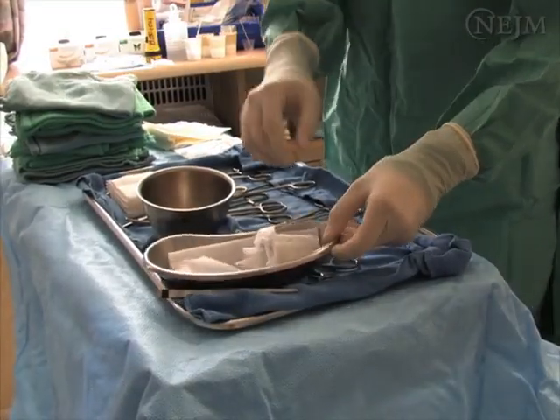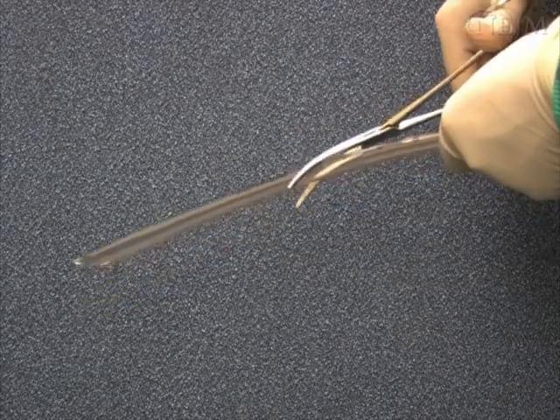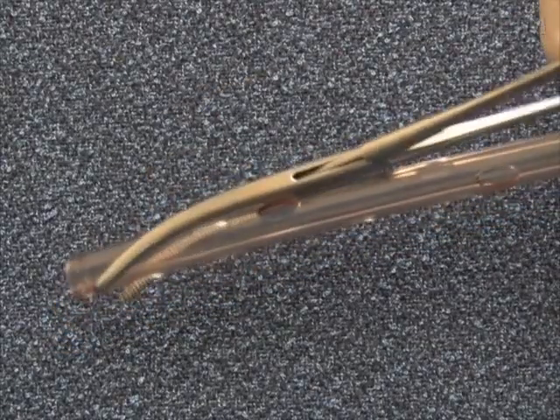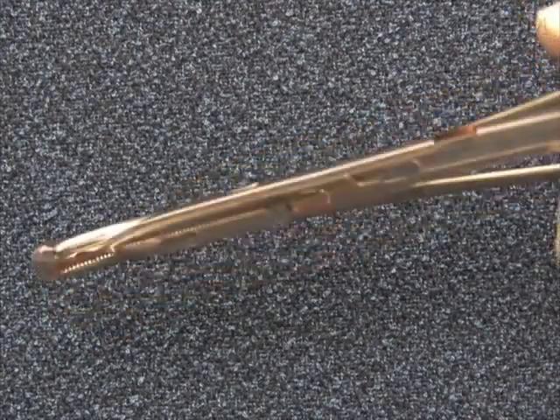Once the chest tube tray is open and all the key instruments are identified, occlude the proximal free end of the chest tube with a clamp or forceps. Next, with another clamp or forceps, grasp the distal end of the tube. This will aid in passing the tube through the tract.